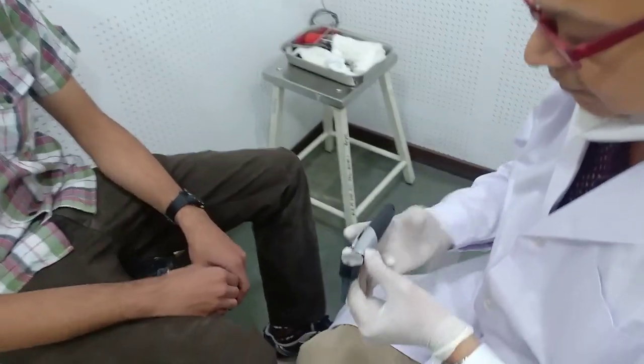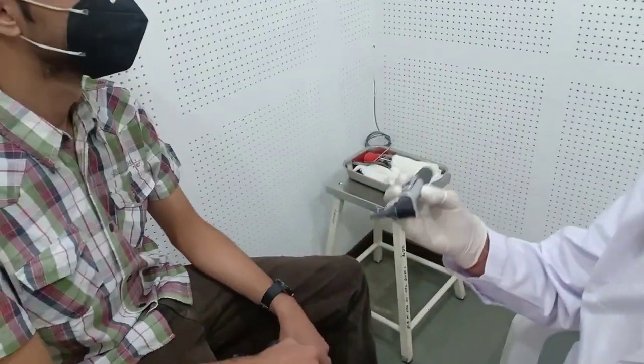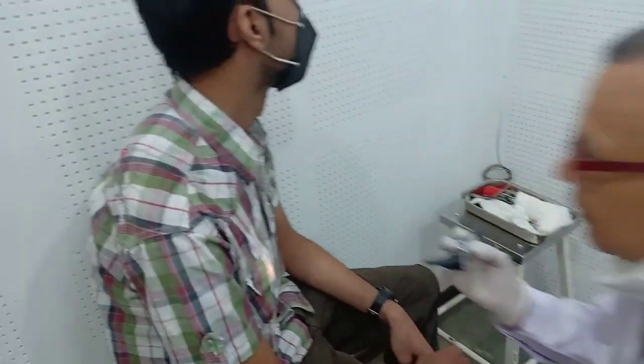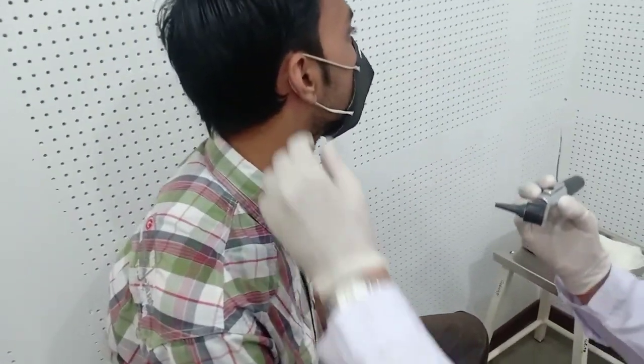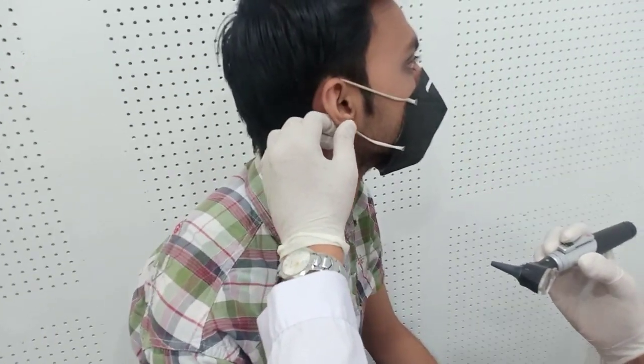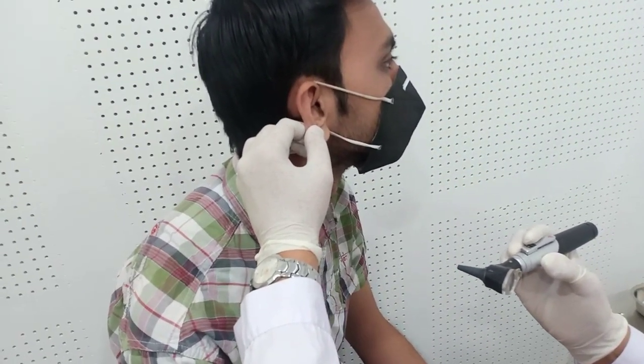For the right ear, we will have to hold it in the right hand like this, and with the left hand we will retract the pinna. Again, the pinna should be retracted superiorly, posteriorly and laterally. In children, it is retracted inferiorly.